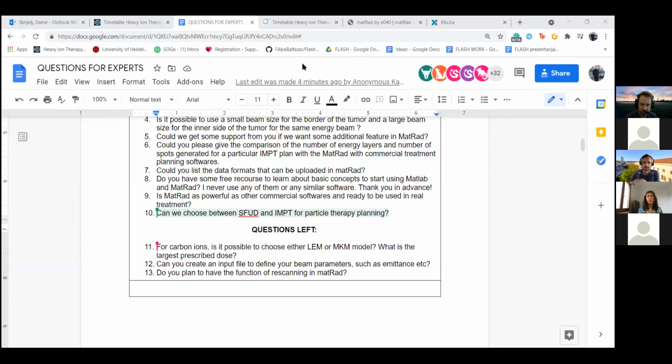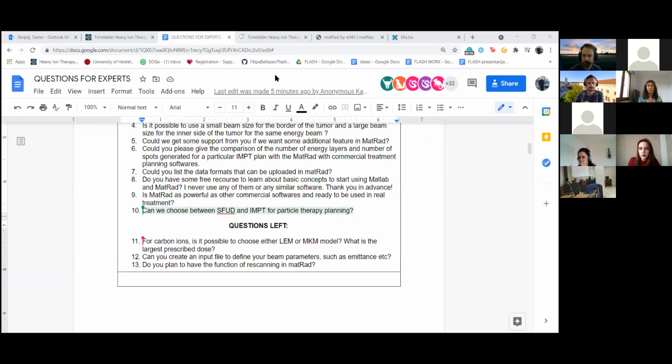And I also wanted to add one more thing to what Niklas was saying: in principle, the framework is there to incorporate other biological models. You just have to implement the model on your own that's producing the biological base data, so to say. But once it's produced by the respective model, it can be integrated easily in the existing framework for treatment planning.